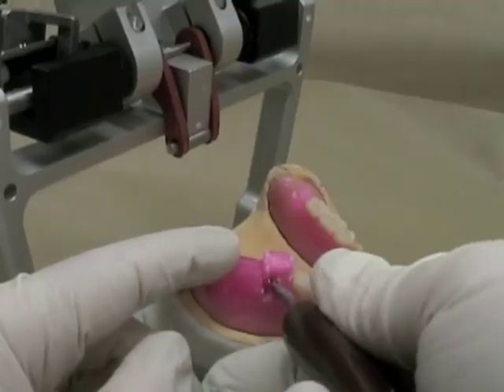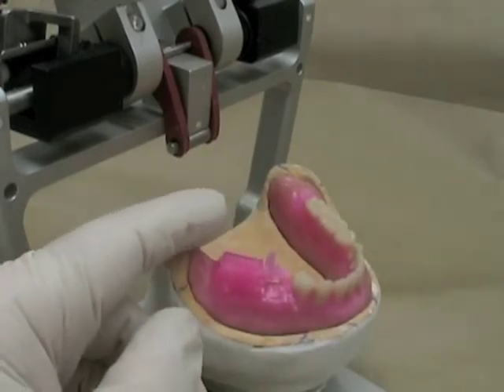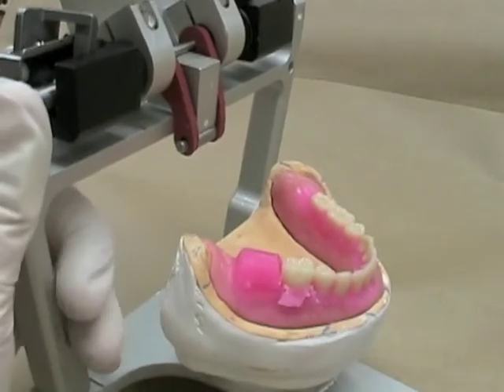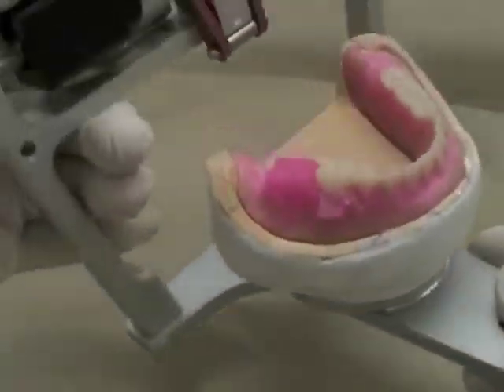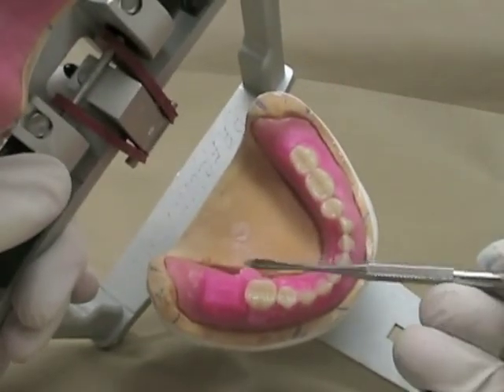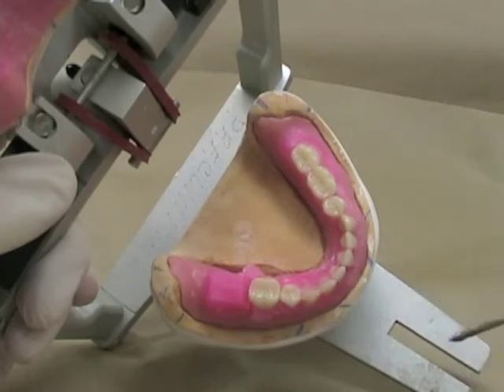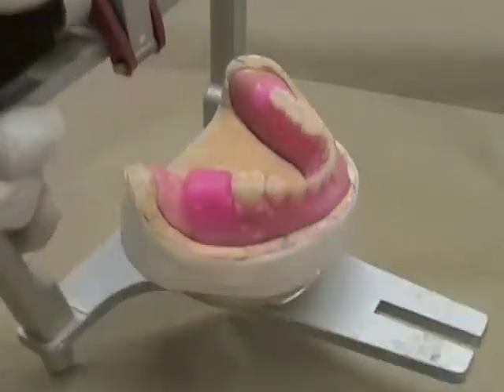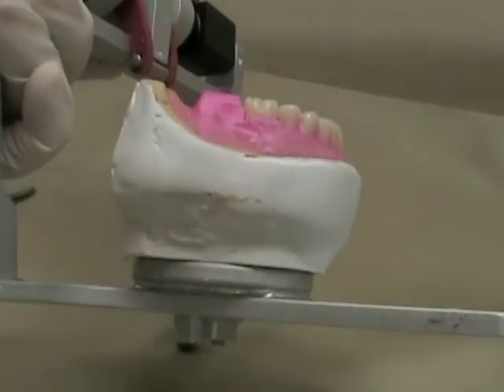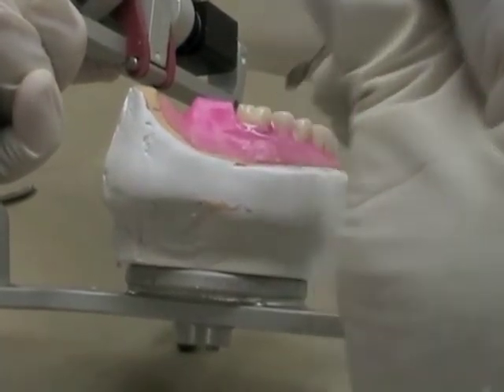I'm going to start to take away some of the wax for my molars. You can see me putting the molars here along the flat plane of the occlusion, and also as we look from above you should be able to see that the line you've drawn for where the middle of the ridge is corresponds to where you're placing your central fossa. We'll just soften the wax around there and then place the second molar.